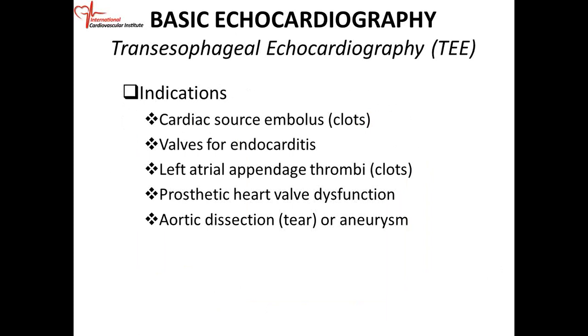So you can see structures 3 millimeters or less with your transesophageal echo. So if you're looking for valvular vegetation and it's not clear on your transthoracic, then a TEE is indicated. If the patient also has endocarditis and you think there are complications such as abscess or fistula, then a transesophageal echo is indicated.